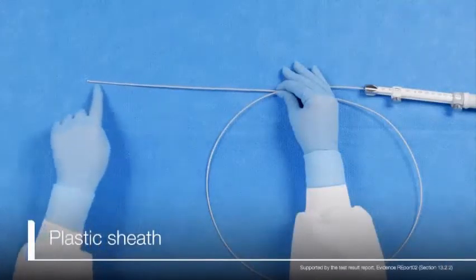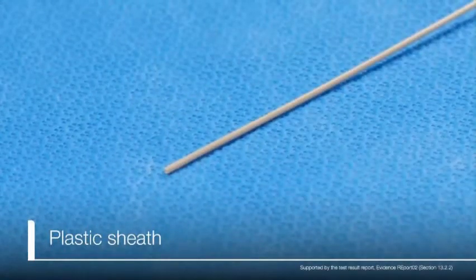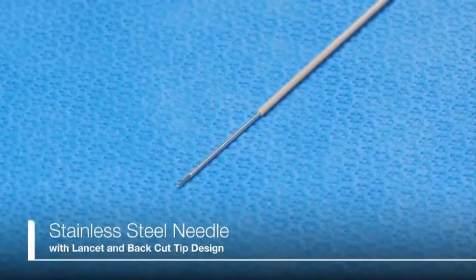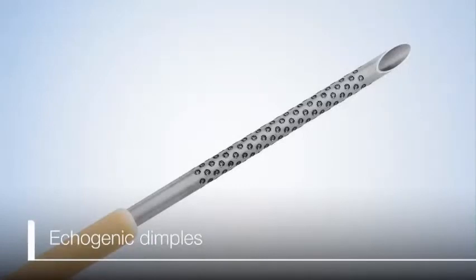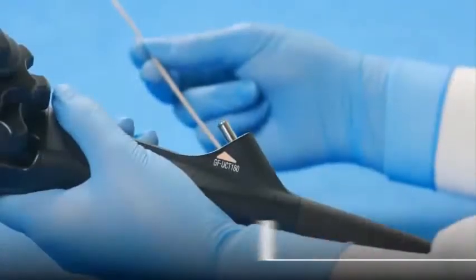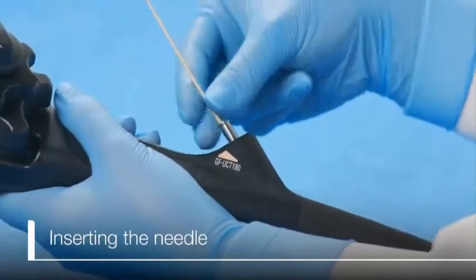The needle has a plastic sheath with a rounded tip on the distal end to prevent damage to the scope working channel during insertion. There is a stainless steel construction at the tip with a sharp end to allow smooth puncture of the target lesion. The distal end must also be echogenic to enable visibility under EUS image. The sheath is designed to support smooth insertion through the endoscope working channel.